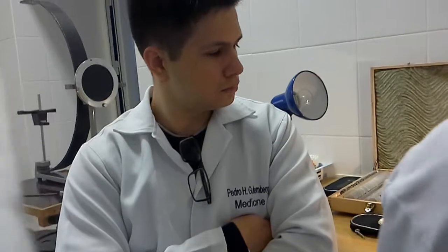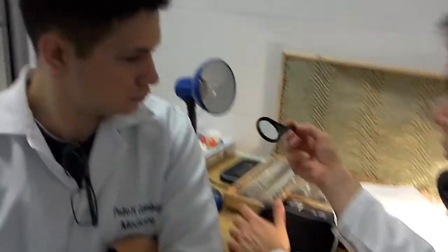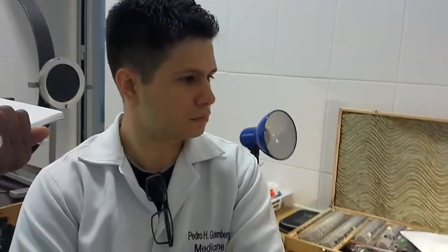So, how do we perform the examination? We use an ophthalmoscope. The ophthalmoscope consists of a mirror and a hole in the center. You are like a photo film — your retina, I mean — the examiner's retina.